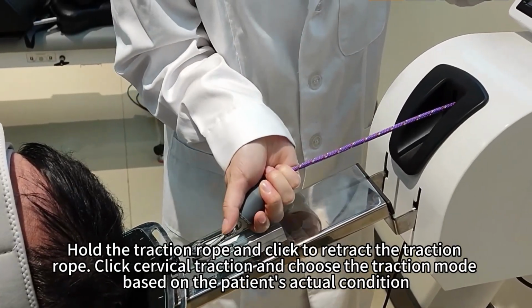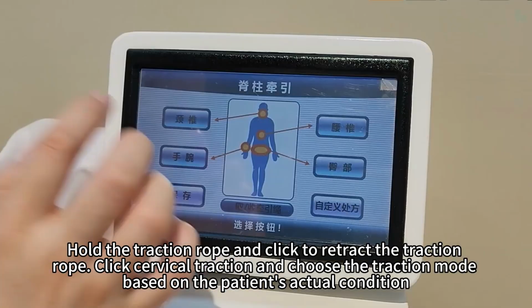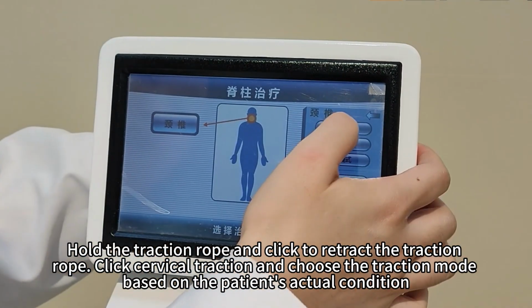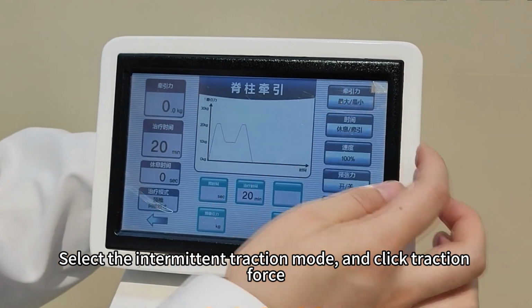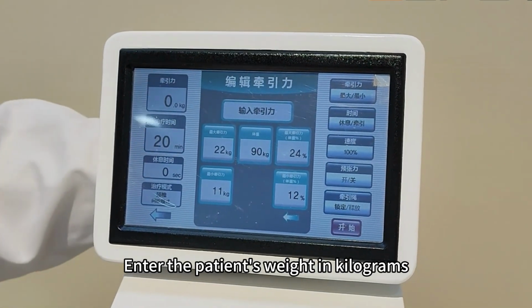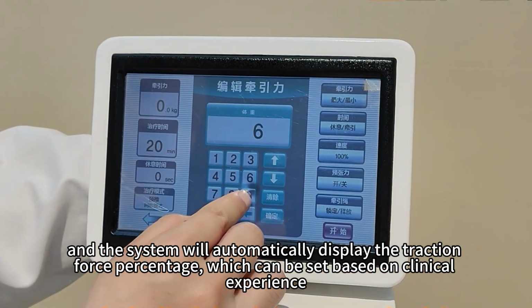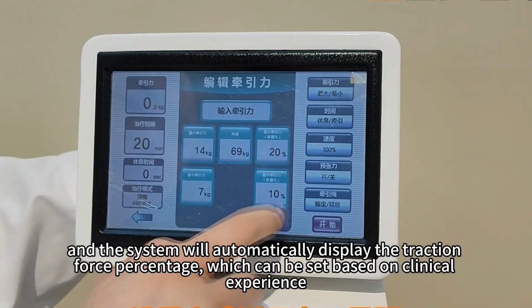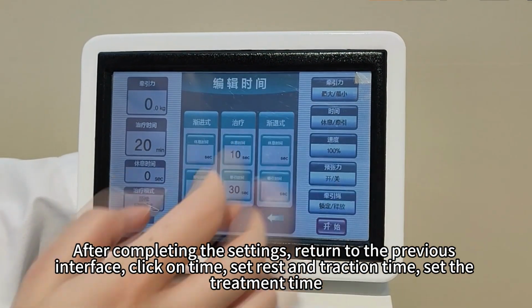Hold the traction rope and click to retract the traction rope. Click cervical traction and choose the traction mode based on the patient's actual condition. Select the intermittent traction mode and click traction force. Enter the patient's weight in kilograms, and the system will automatically display the traction force percentage, which can be set based on clinical experience. After completing the settings, return to the previous interface.